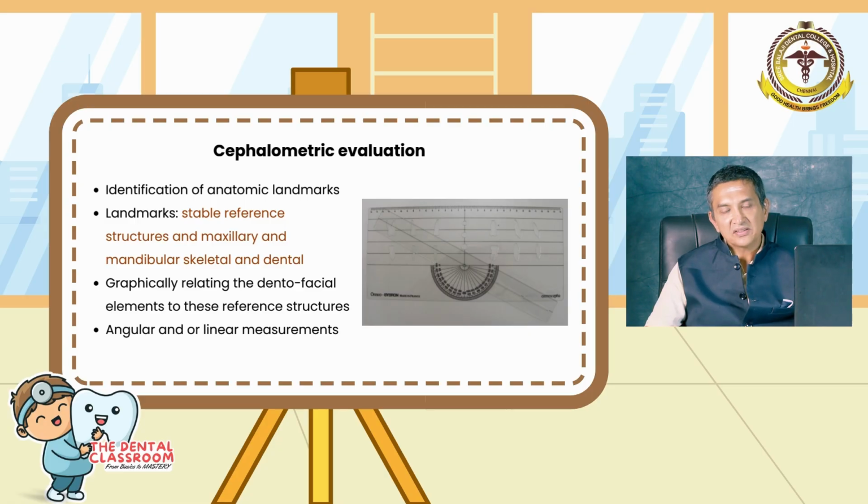Based on these points, we can have either an angular analysis or a linear analysis. As the term indicates, angular analysis is based on angles, whereas linear analysis is based on a minimum of 2 points and is measured in either millimeters or centimeters. Another variation of the linear analysis is a ratio-based or proportionate analysis. So we can have proportionate values, linear values, or angular values.